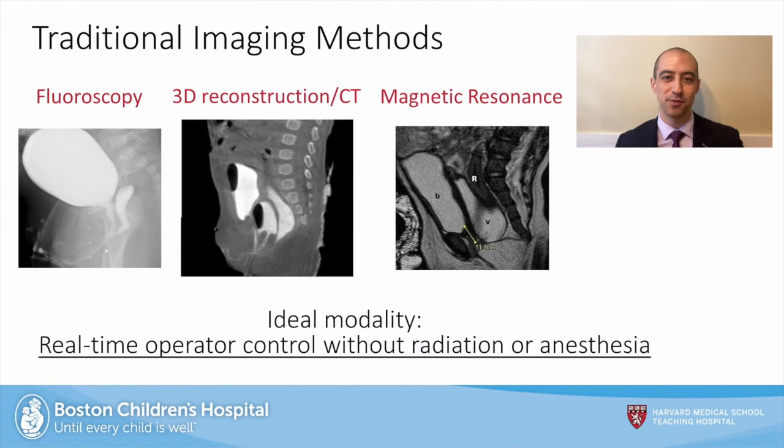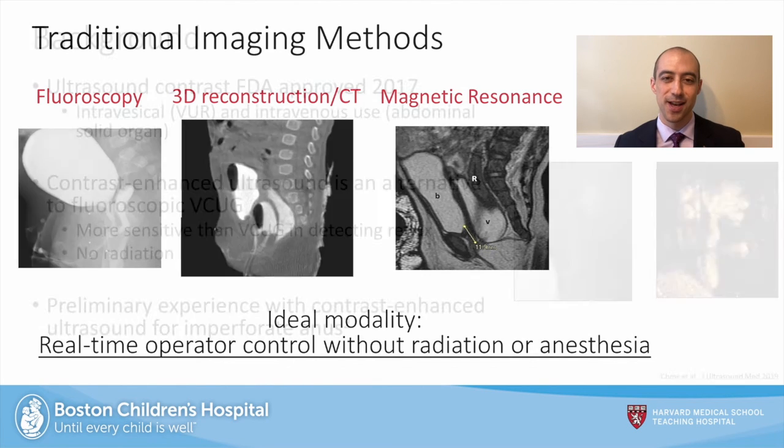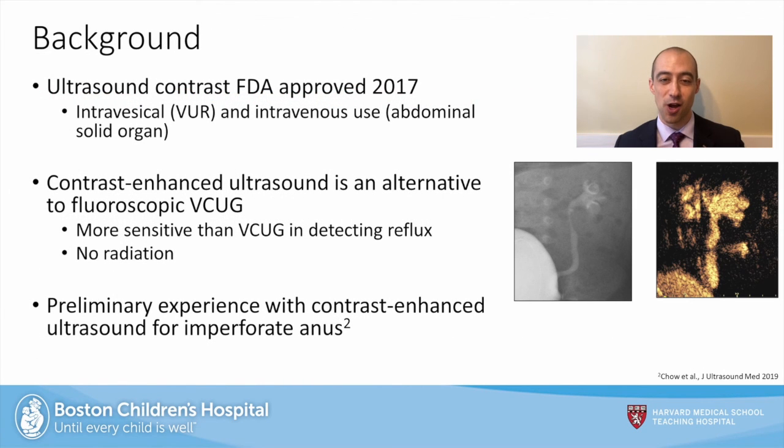There are multiple types of imaging techniques that can be utilized to help elucidate these relationships, but they involve ionizing radiation, may require sedation, or may require distension of the rectum to supraphysiologic intraluminal pressures. An optimal study would provide this information without the need for radiation or anesthesia, and also pose minimal risk to the patient. Some recent developments in the field of contrast agents have allowed the emergence of an ultrasound-based study that avoids these risks while still providing high-resolution information in 3 dimensions.